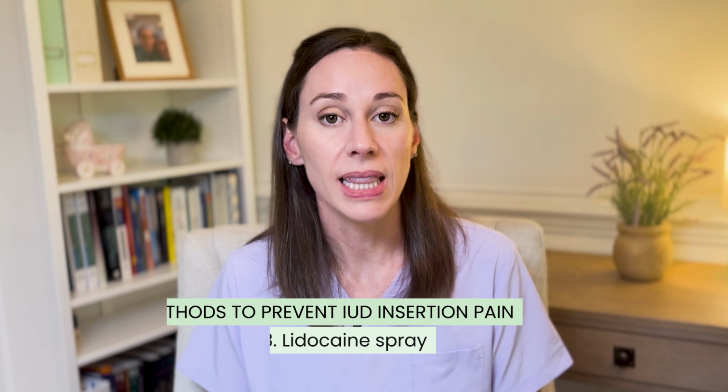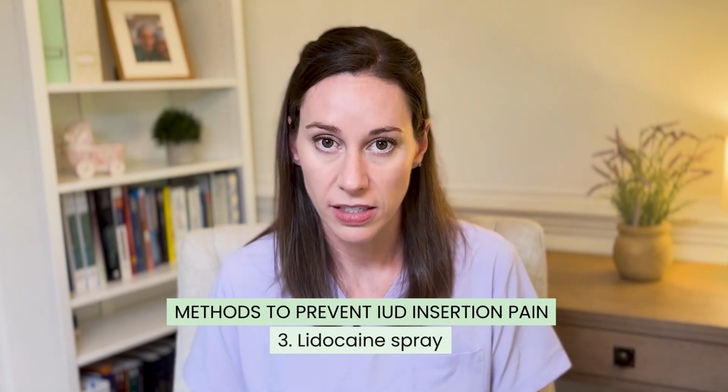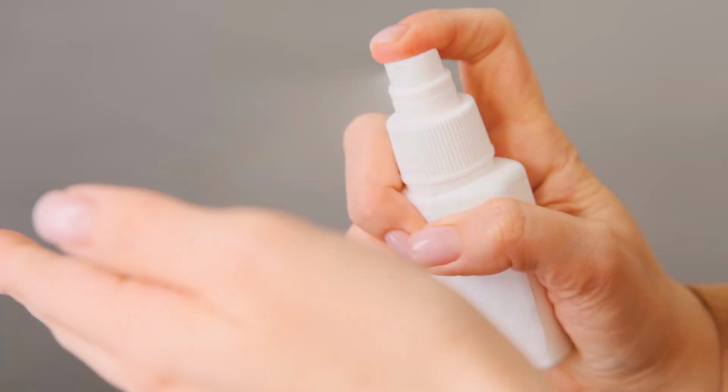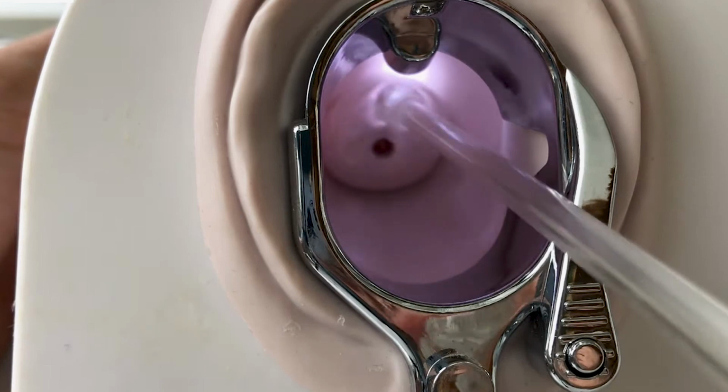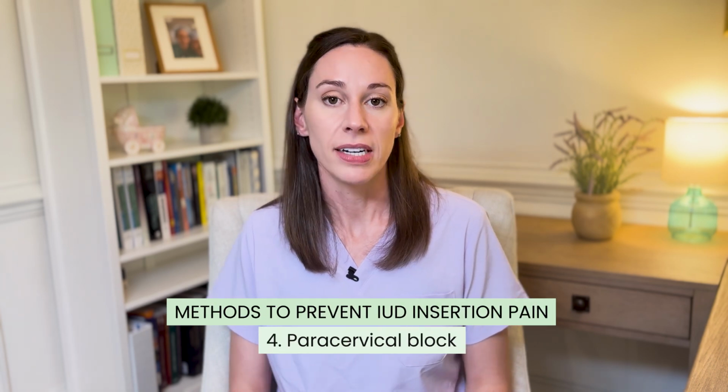The next step up would be a Lidocaine Spray, which is sprayed on the cervix to provide some of that numbing effect to the cervix itself. Now, the downside of this is that it doesn't work right away. So if you want to have this done, you'll have to have a speculum placed, spray applied to the cervix, speculum removed, and then wait about 3 to 5 minutes, place the speculum again, and then go ahead and do the procedure. So certainly if you want to have that numbing spray on board, that would be something that you can do. Just be aware that it does take a little bit of time and you may have to have a speculum inserted twice. So another option that we have is what's called a Paracervical Block.